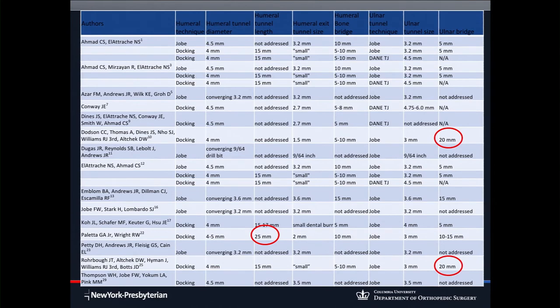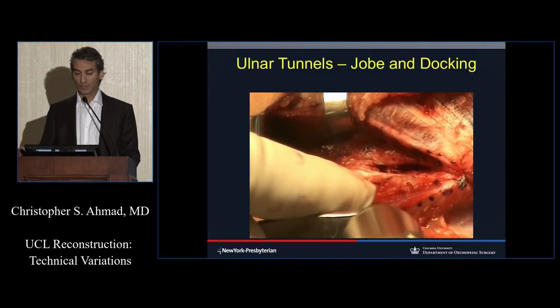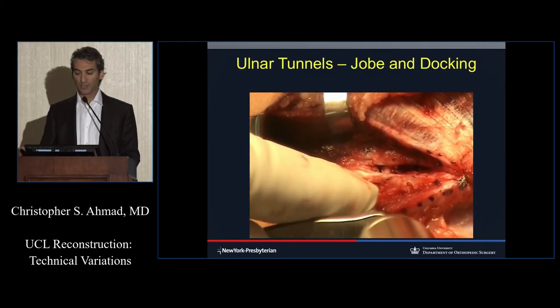We'll talk about the humeral tunnel length. This is George's work. George is here. And he gets 25 millimeters. He goes way up. This is on the humeral side. It's drilling a depth of tunnel. I'll show you what that means. But getting adequate depth is another feature of this. So what do I mean by getting a bone bridge that's adequate?